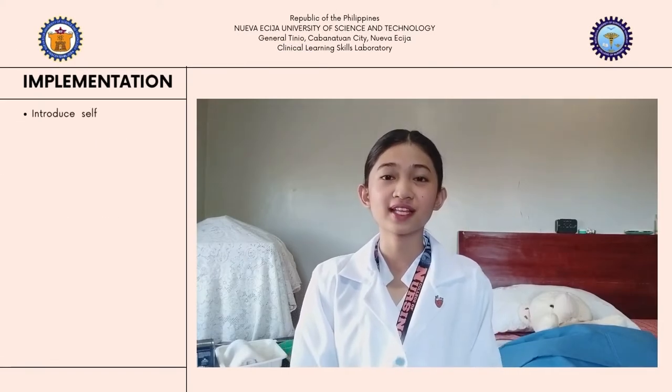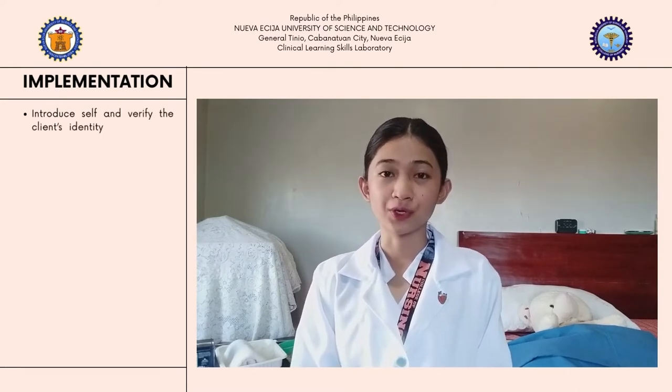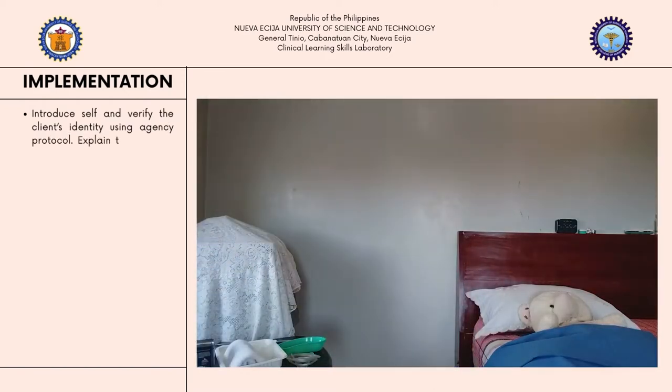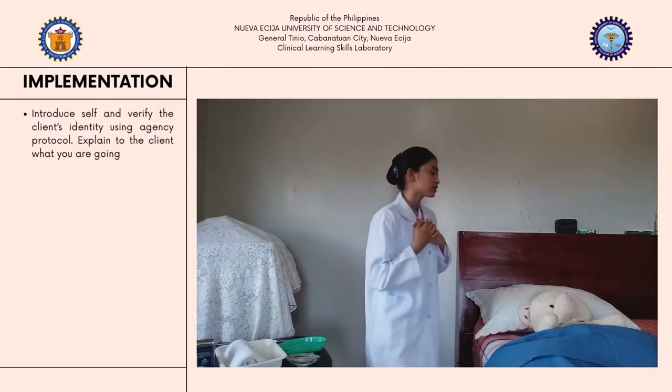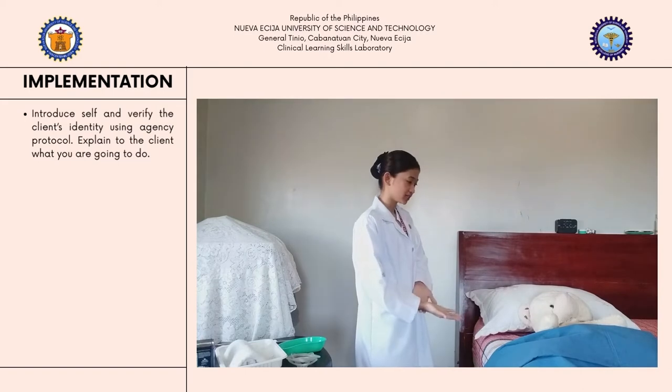Introduce yourself and verify the client's identity using agency protocol and explain to the client what you are going to do. Good morning, ma'am. I'm Hanz Nicole from the NSC and I will be your student nurse for today. May I know your name, ma'am? And your date of birth?